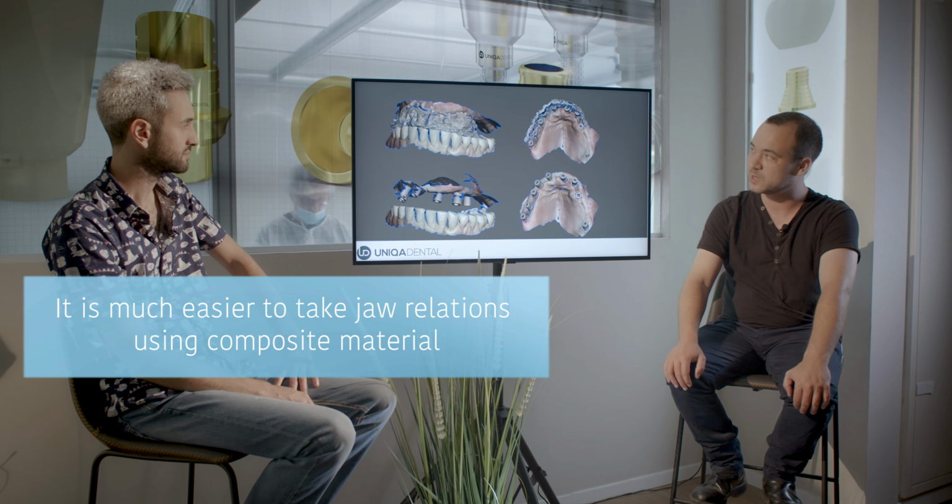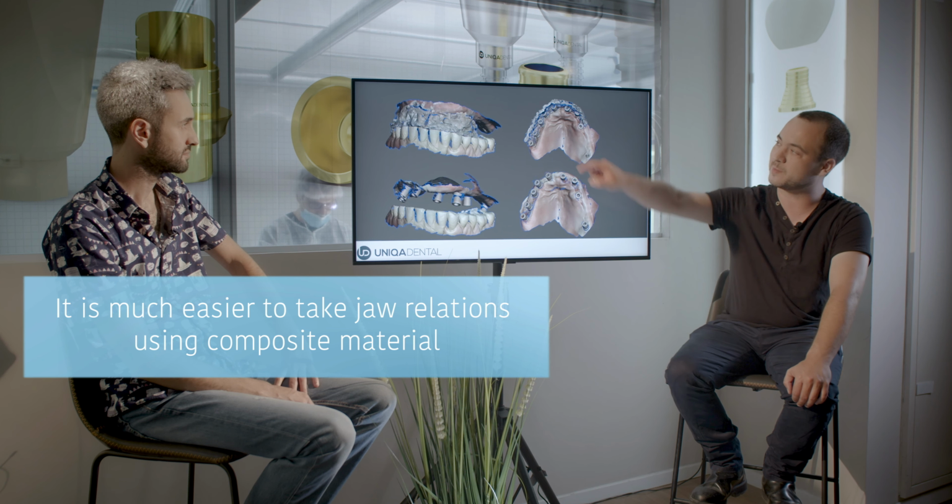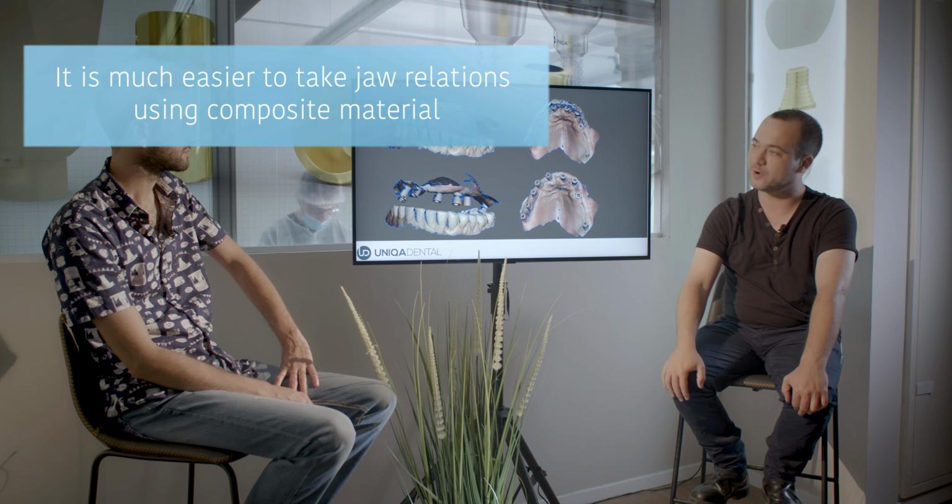So what we're using is composite material. We lay the composite material on the buccal side of the scan abutments. So you have the same scan abutments, but you have a rim of composite in the buccal part. The composite material is in relation to the lower jaw, so you have the indentations of the lower teeth, you have everything you need, you scan it, and you can place the clean jaw on top of the jaw with the composite material.